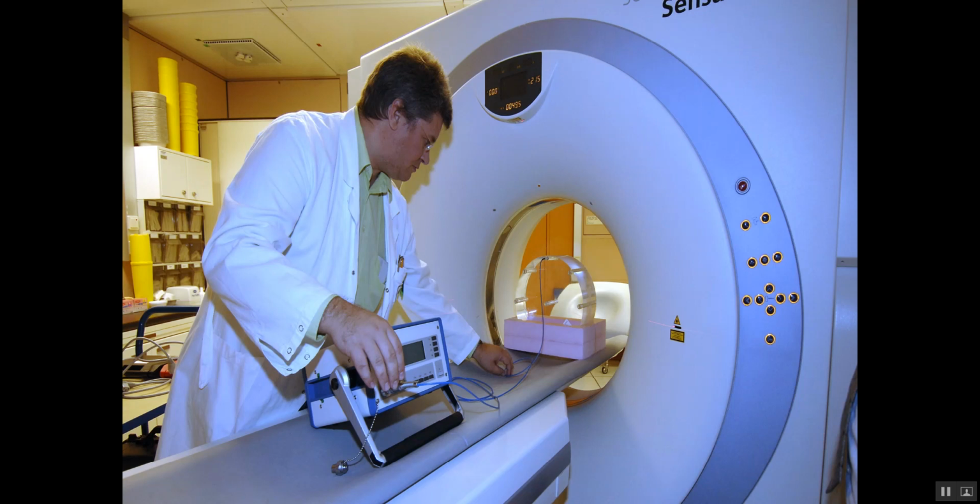Before the machine comes to us here in our hospital, it must be calibrated to set all these values. So when you change kV, milliampere, the rotation time and the pitch factor, you will get the CTDI volume because it's calculated before. It's already calculated before the machine comes to your place.